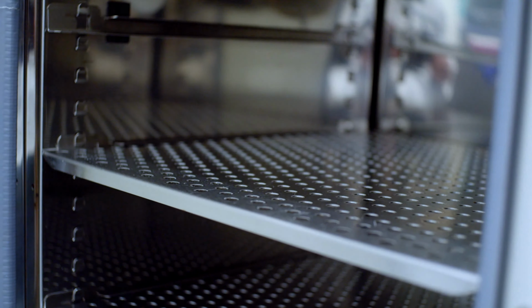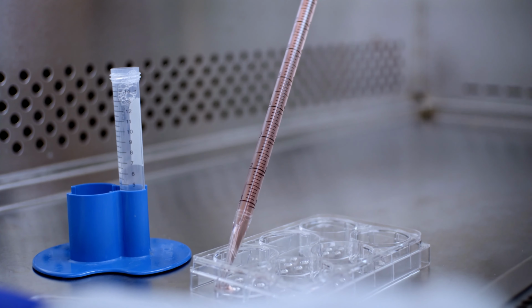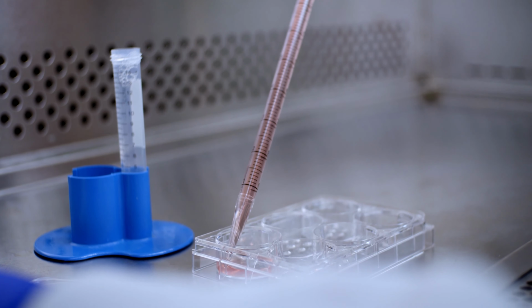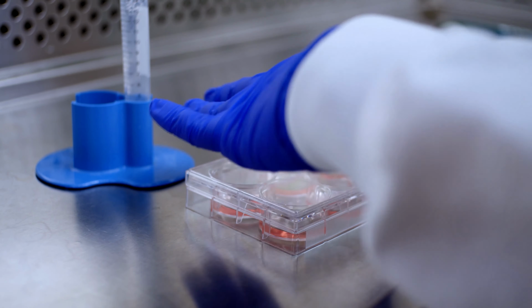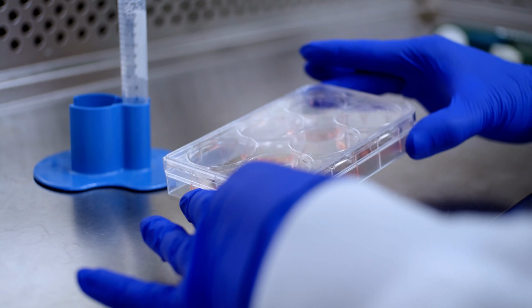Once the domes are polymerized, add growth media into the culture wells, being careful not to disturb the Cultrex BME domes. Your Cultrex BME domes are ready for continued culture. This concludes the handling protocol for Cultrex BME.